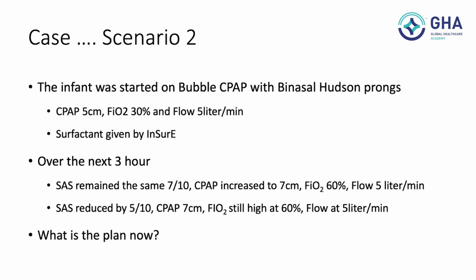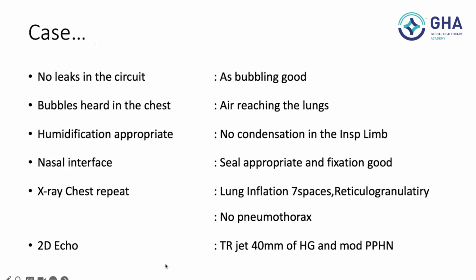So ensure that your CPAP is delivered appropriately before you take another action of correcting the hemodynamics, going up more on the pressures, giving a second dose of surfactant, or NIV or ventilation. So the plan in this baby would be to check for leaks. Bubbles are seen, bubbles are good, no leaks in the circuit. Bubbles are heard in the chest, air is reaching the lungs. Humidification: no condensation in the inspiratory limb, some condensation in the expiratory limb.